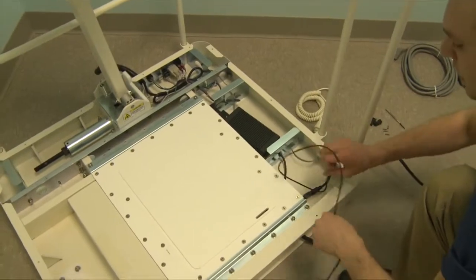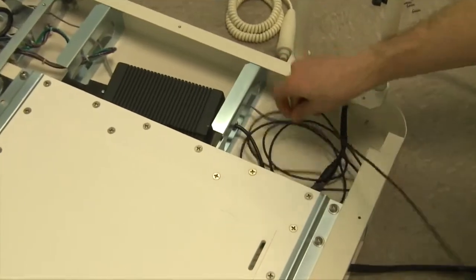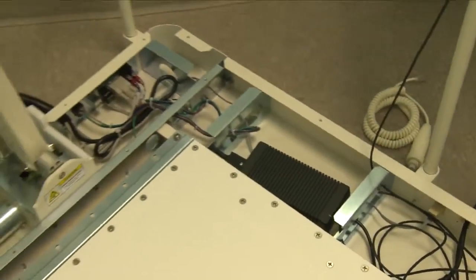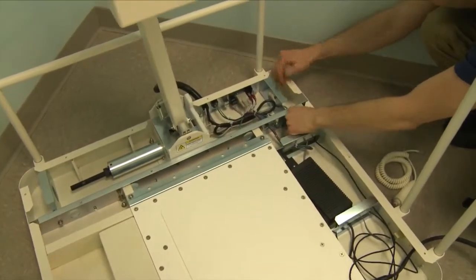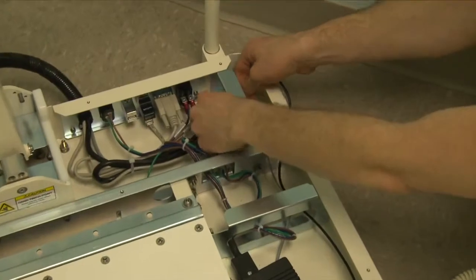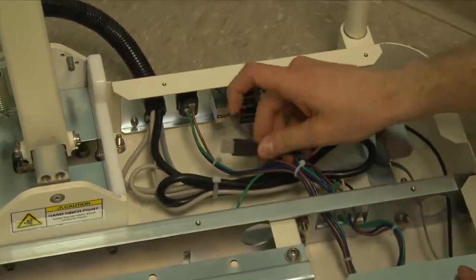Now we're going to take the USB cable. You can go ahead and unravel it up in here. We're going to run it to the back of the base, running it through all the openings. We're going to go ahead and plug it in to the back USB port on the back of the base.